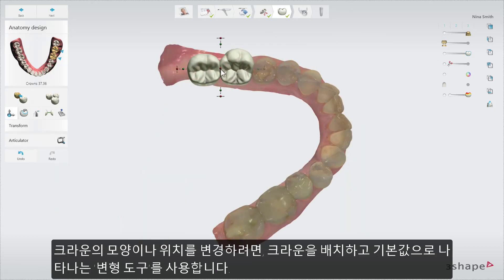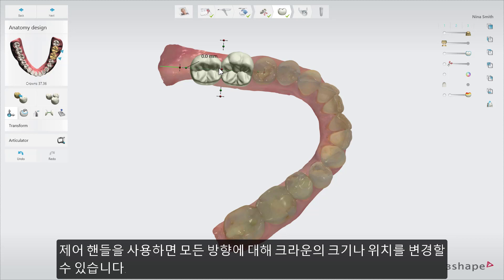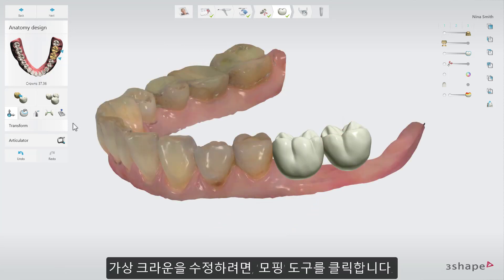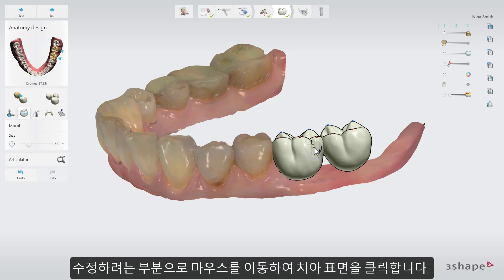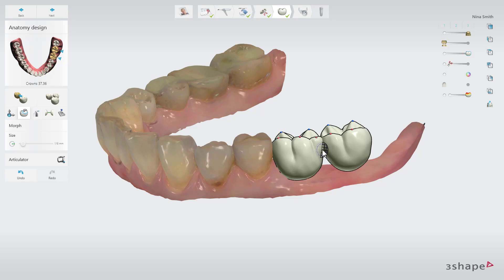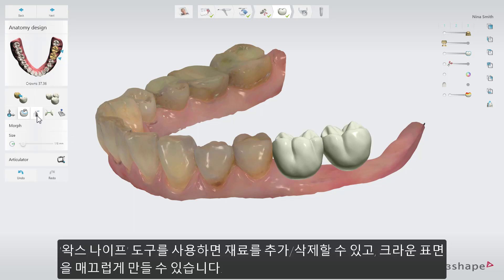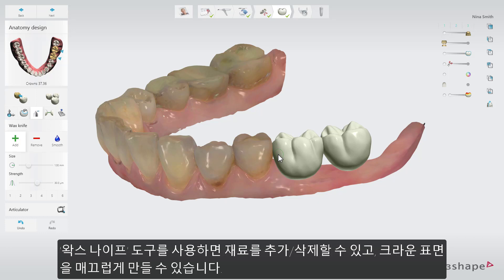To modify the crown shape or position, use the Transform tool, which is selected by default once the crown has been placed. Use the control handles to adjust the size of the crown or its position in any direction. To make adjustments to the tooth anatomy, click the Morph tool. Here you can adjust the size of the area on the crown you wish to influence by holding down Shift and using the mouse wheel to scroll. Click and move the mouse on the surface of the tooth to modify it. You can also use the Wax Knife tool to add or remove material or to smoothen the crown surface.